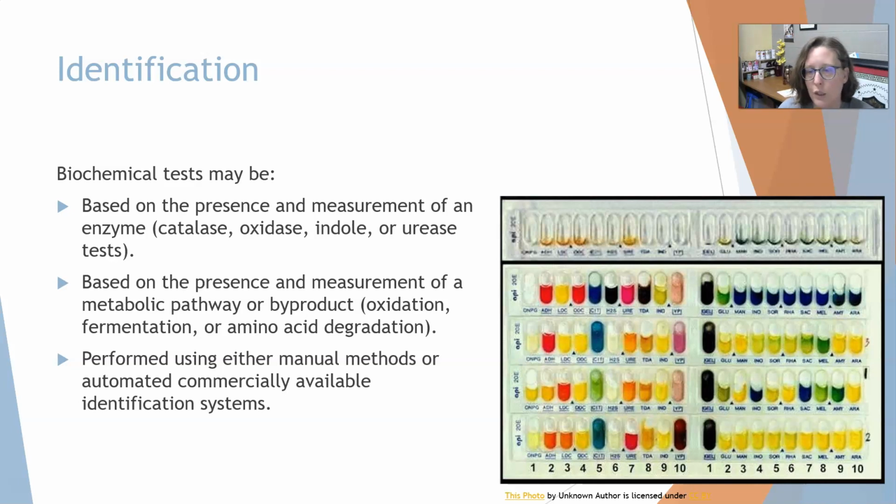And so this used to be done by heavily manual methods. A lot of this has been automated, so that, again, once you've inoculated that, the bacteria have to grow and then ferment or metabolize different things.